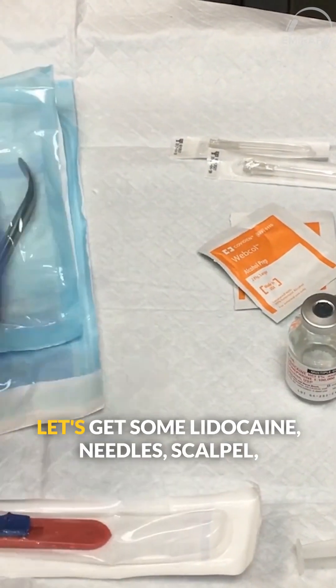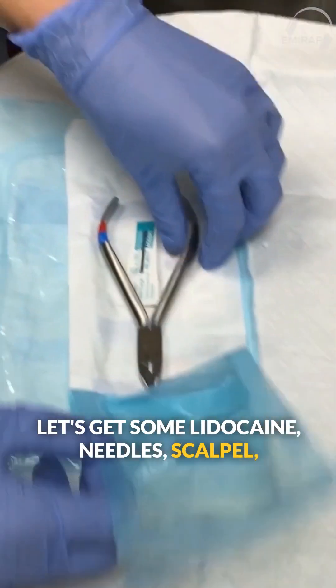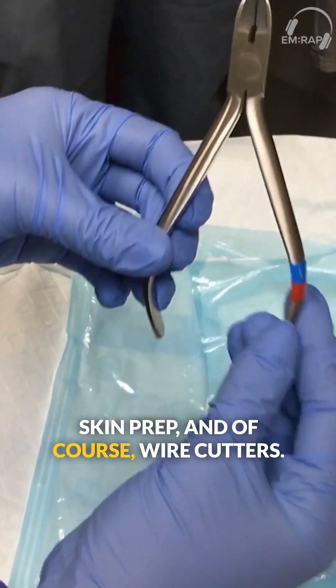So you're going to get your supplies: let's get some lidocaine, needles, scalpel, skin prep, and of course, wire cutters.